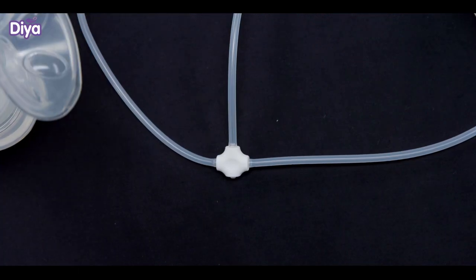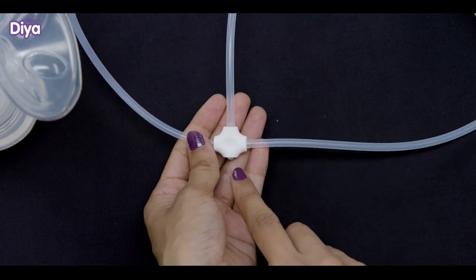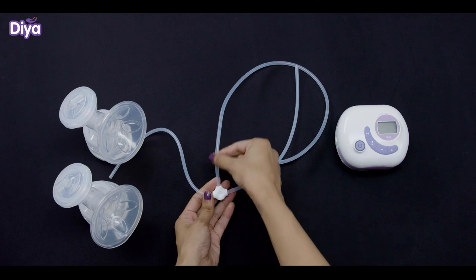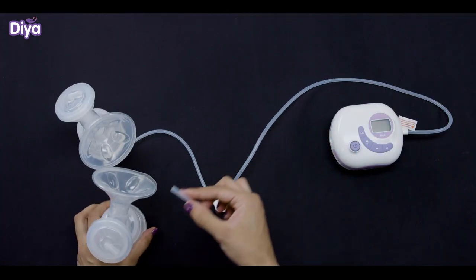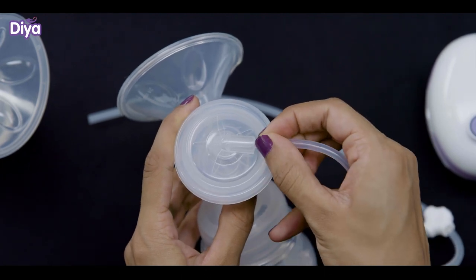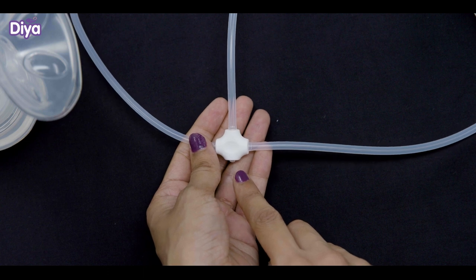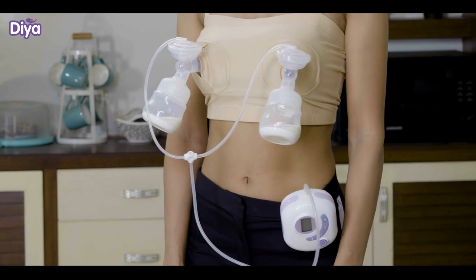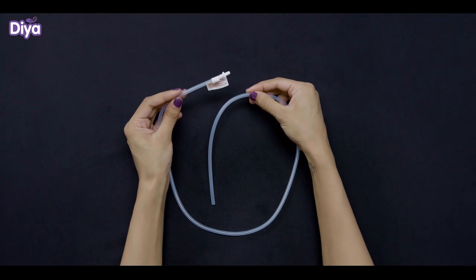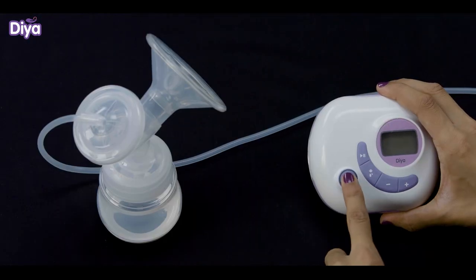Ensure that the tube is connected to the end opposite to the arrow. The double pumping tube has four openings at the center. The side opposite the arrow should be connected to the motor and the right and left should be connected to each cylinder cover. The one which has an arrow should be left as is. Note that you should use the double tube only if you are pumping both sides. If you are doing single side pumping, then use only the single tube which doesn't have the white colored center.